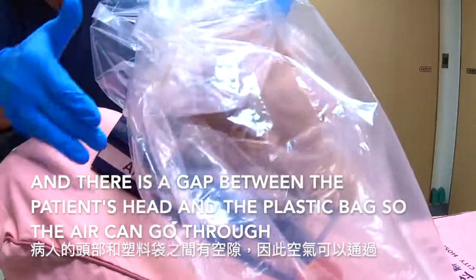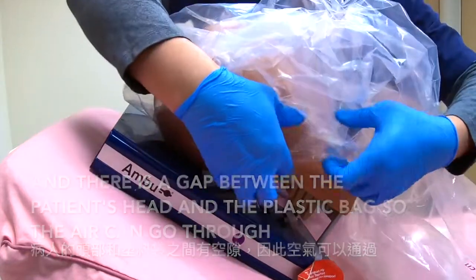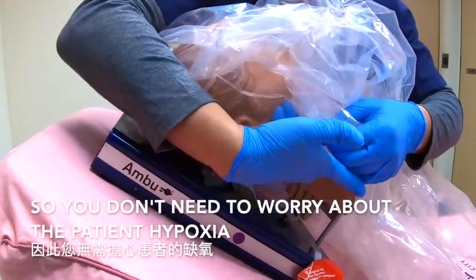There's a gap between the patient's head and the plastic bag so the air can go through. So you don't need to worry about the patient experiencing hypoxia.